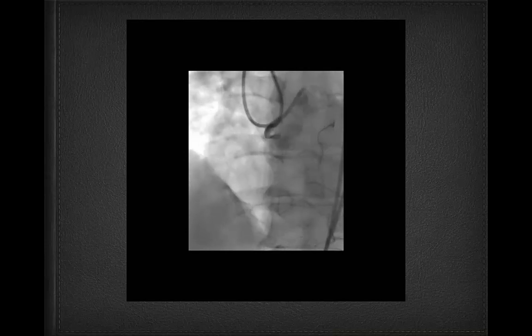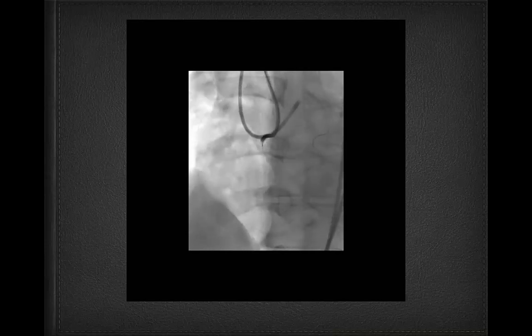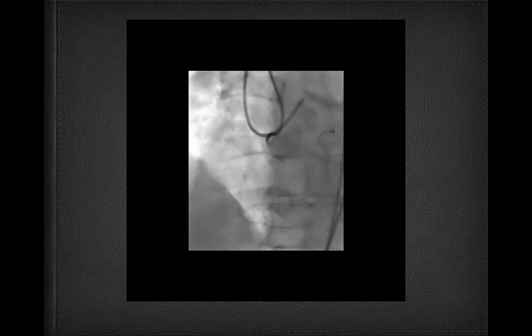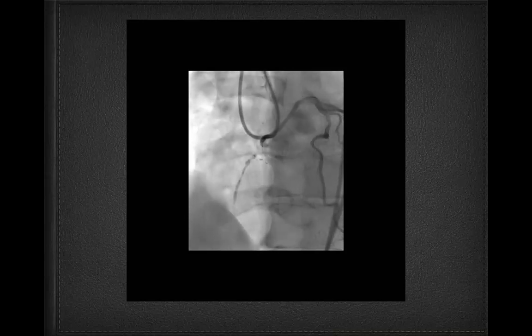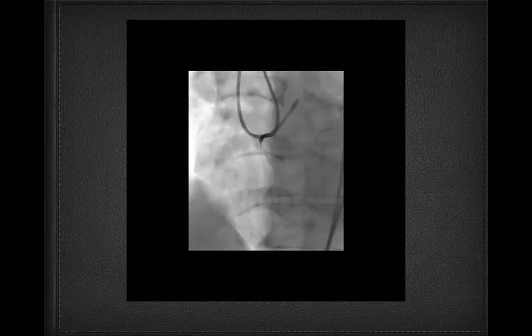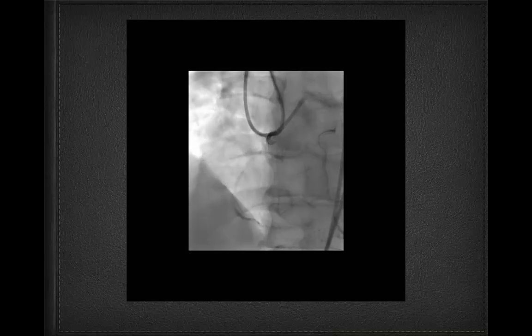So I used in that point the Confianza to puncture the proximal cap, and I need to use it without pushing because the support was present but was not so good. If I use a Gaia, for example, I need to push a little bit more than the Confianza to penetrate, and the problem is to get outside the ostium with my guiding catheter.